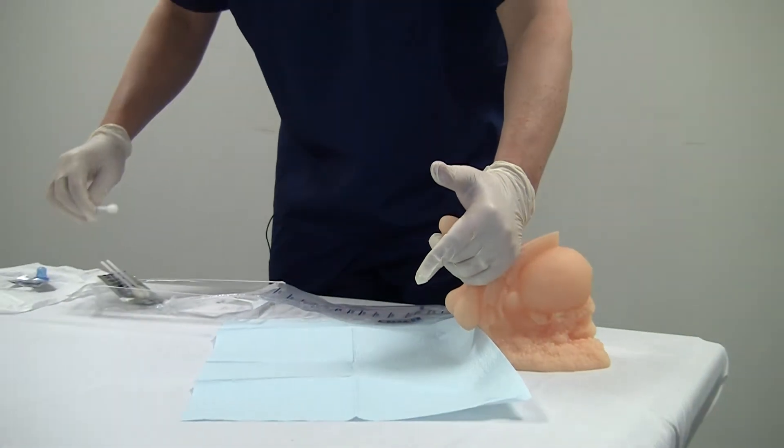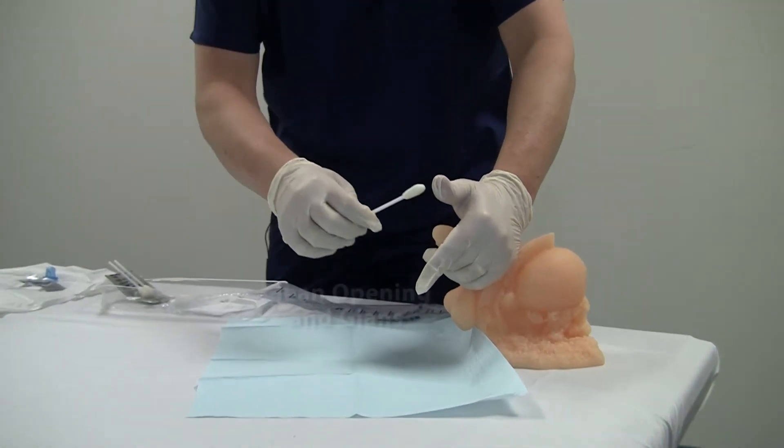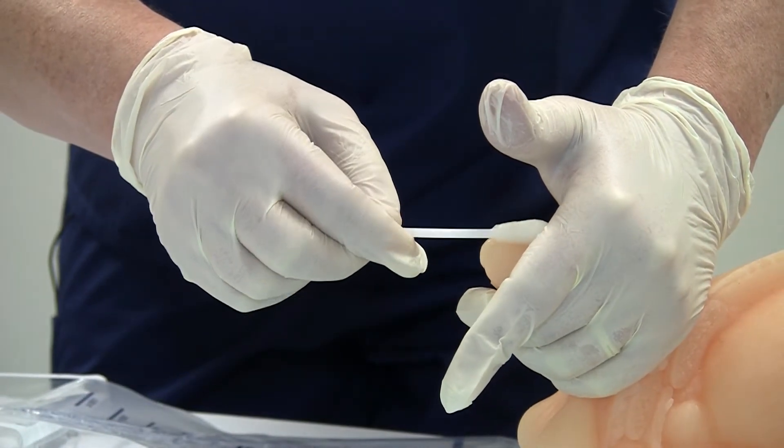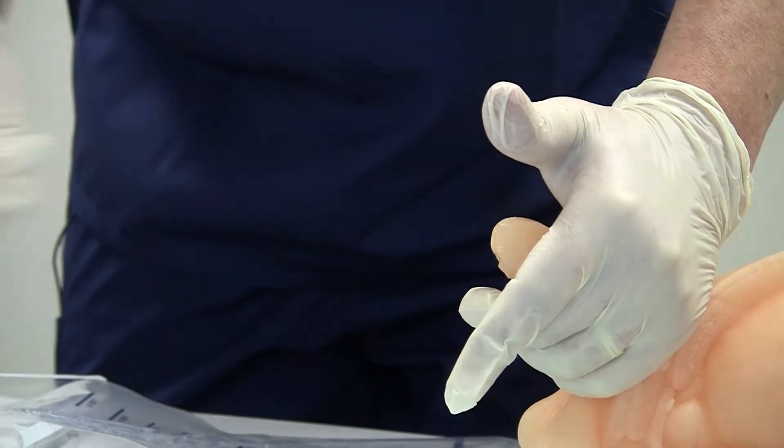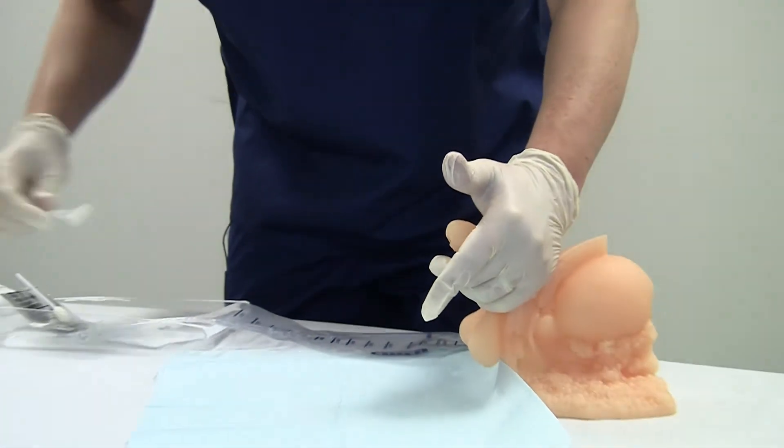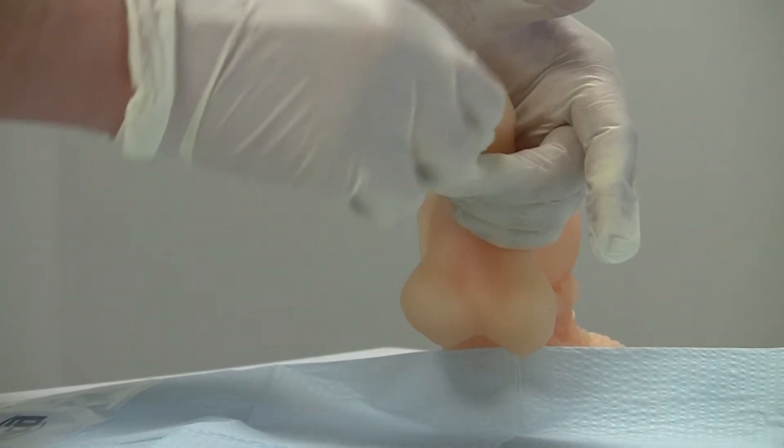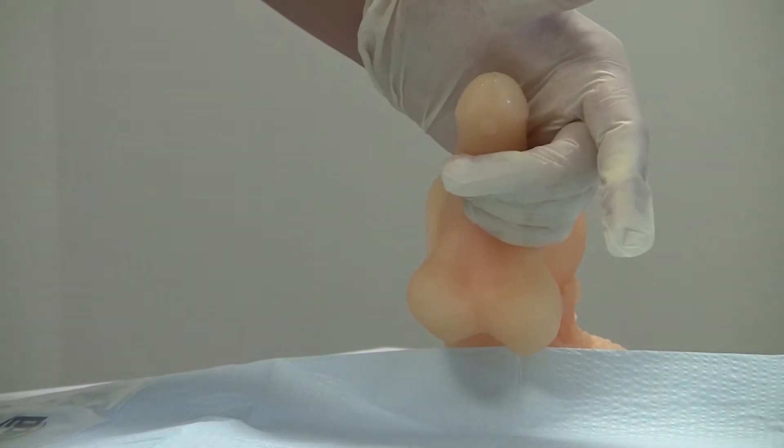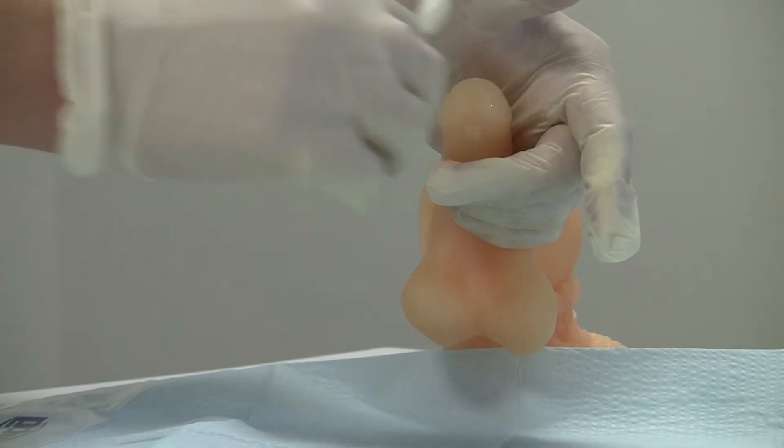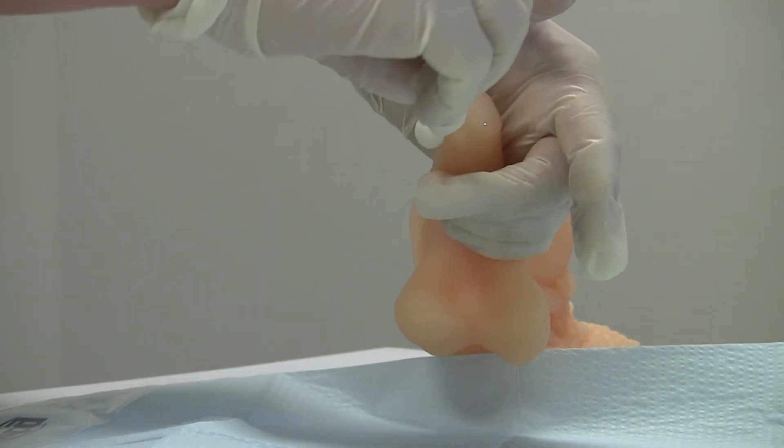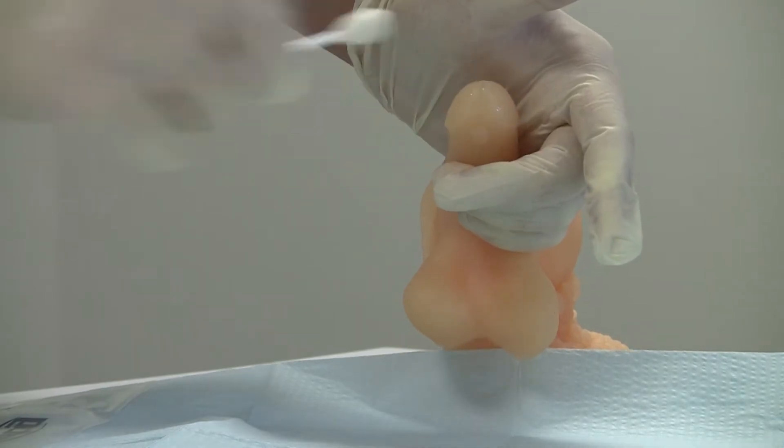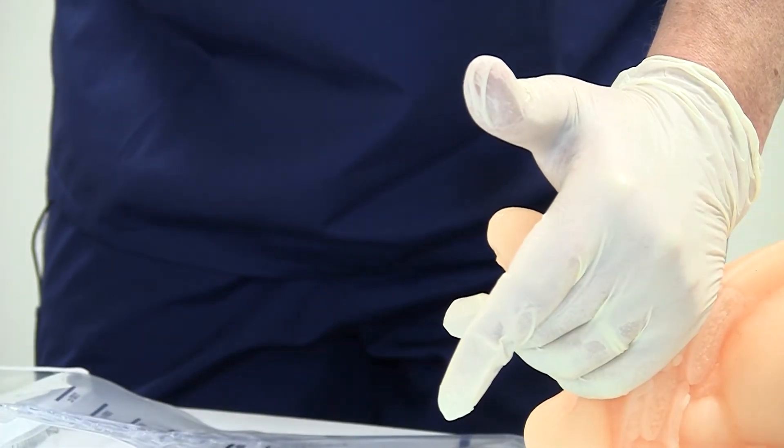Go back and get your swab sticks and go right over the urethral opening and around the glans one time with each swab. This cleans the area out around the glans. Notice too that benzalkonium chloride is clear as opposed to the iodine products so we don't end up with a big mess.